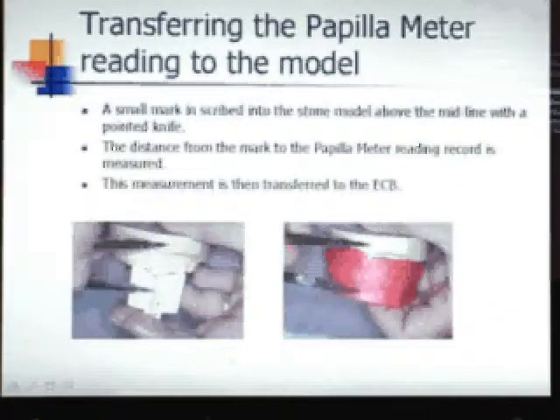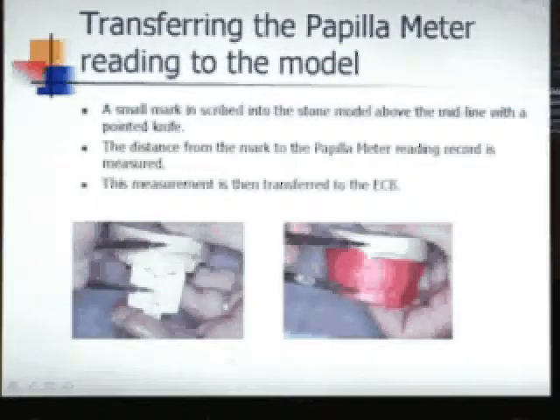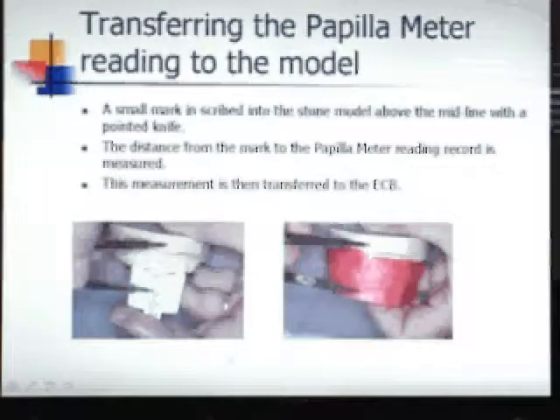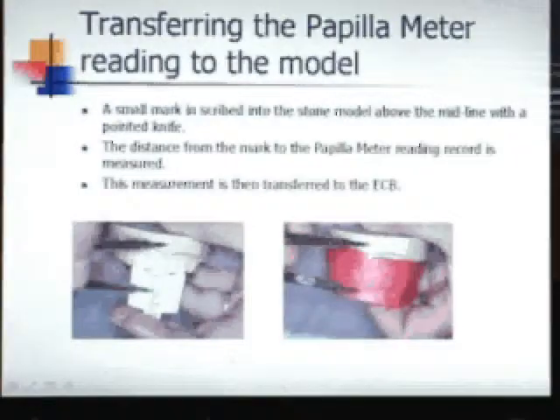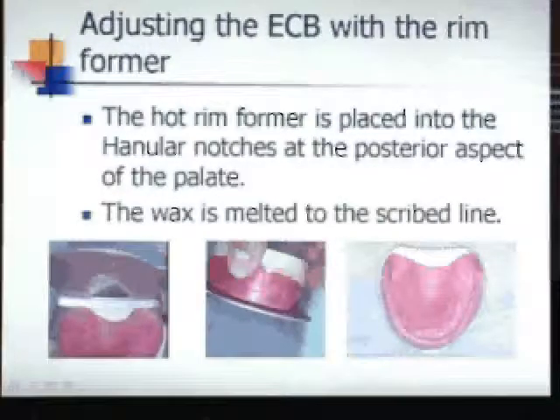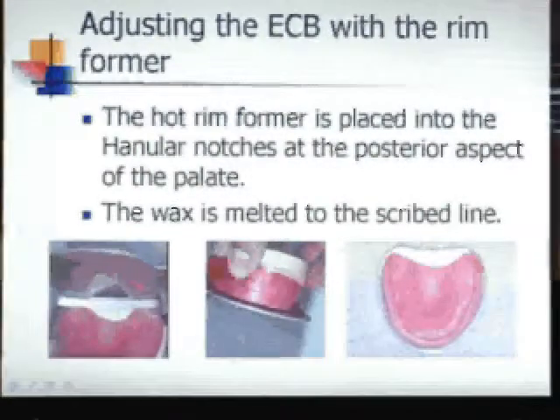The Papilla Meter reading is transferred to the ECB by setting a reference mark on the model with a pinhole and transferring from this point to the predetermined measurement taken from the patient. This measurement is then transferred to the ECB. The rim former is heated up and used to melt the wax on the ECB to the mark placed there by the Papilla Meter transfer.